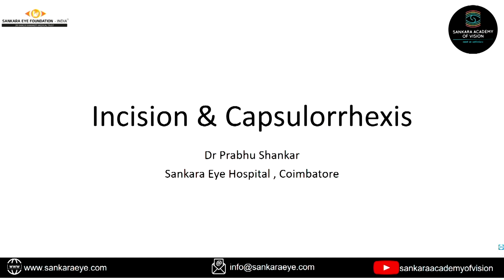I think before starting Phaco, incisions are very important, because if your incisions go wrong, your fluid dynamics inside goes wrong, and then the surgery is going to be very difficult. So incisions during Phaco are very important, because it is the first step.